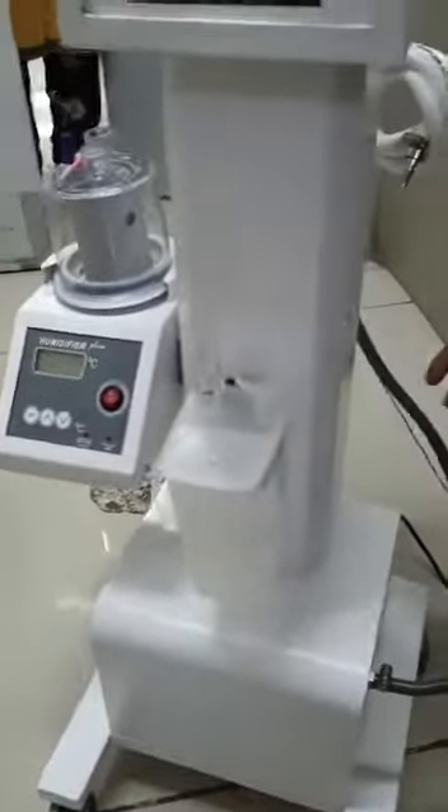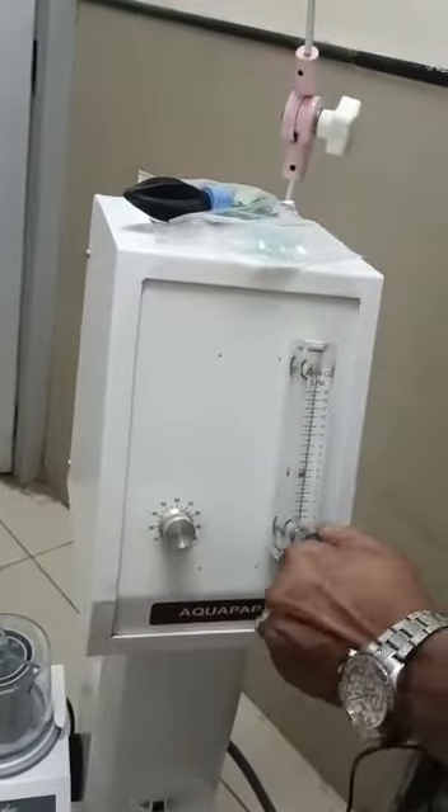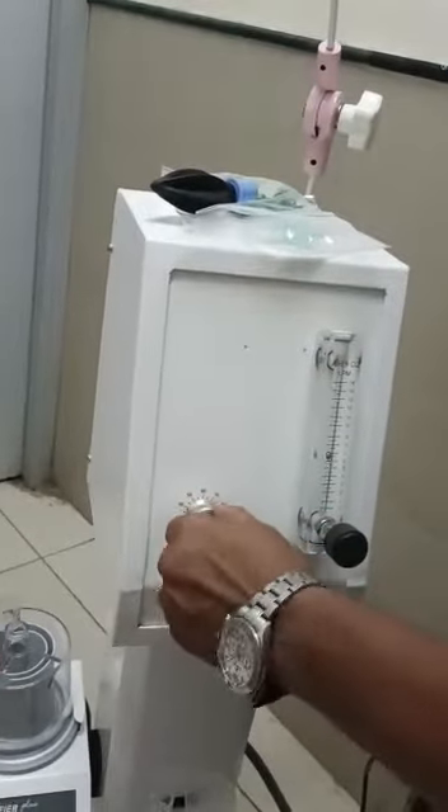Behind there is an on-off switch. Switch on — the machine switches on. From here you set the air pressure, and from this you can set the oxygen pressure.